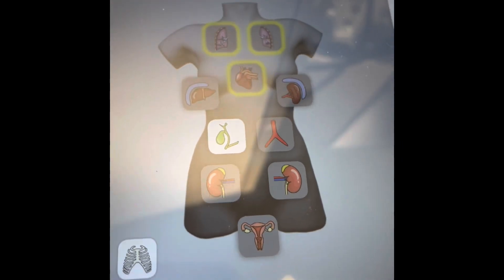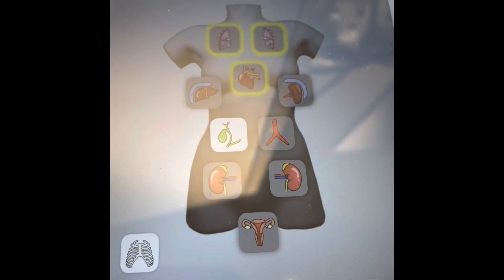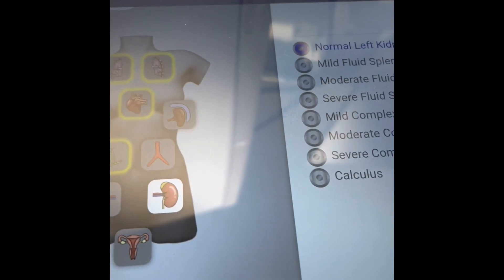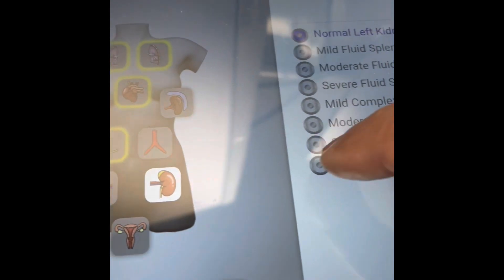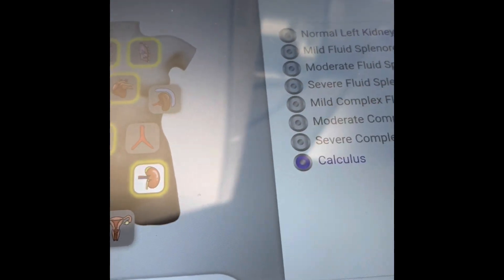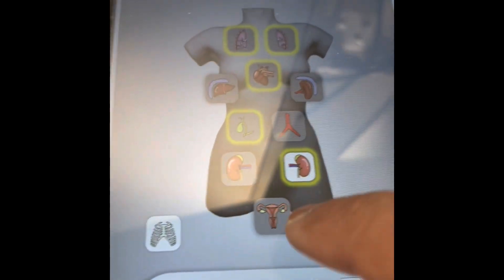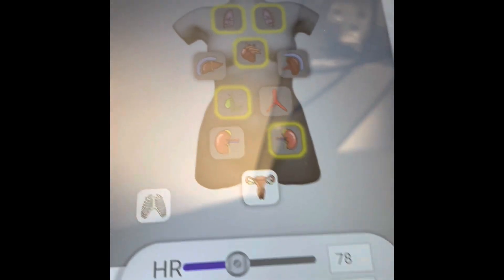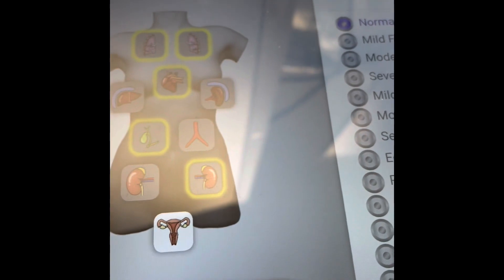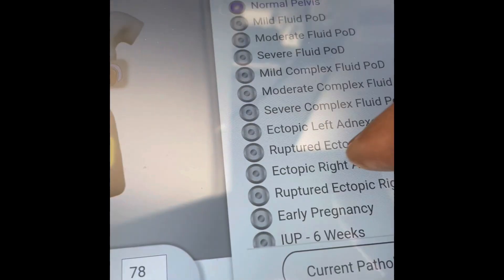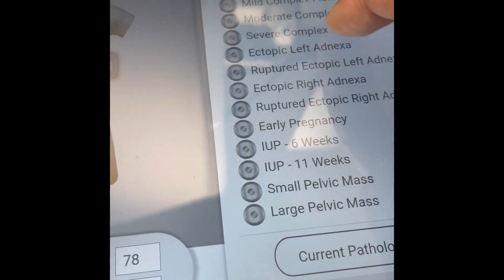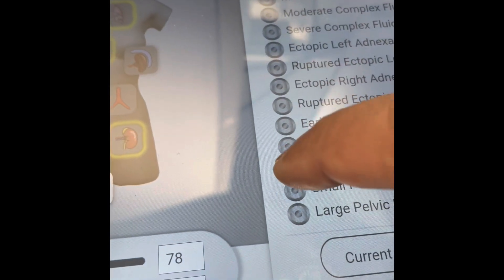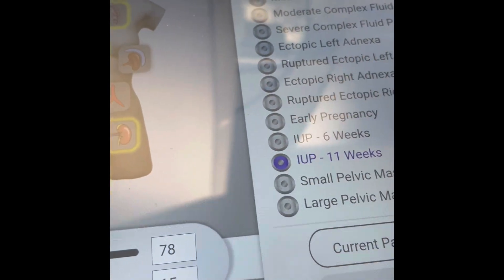That's your gallstone. Go to the left kidney — let's make her have a kidney stone. And let's make Maya have a baby, and let's say the baby is 11 weeks.